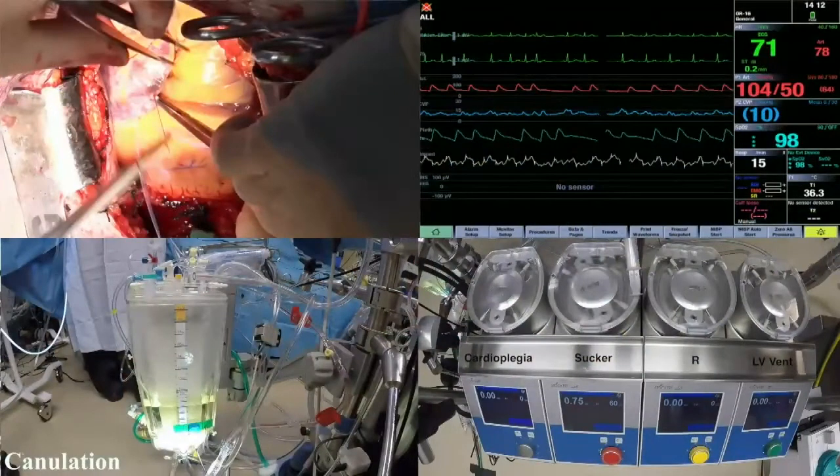Adrian, if you're watching. But when we first did it, you'll notice that we're missing that panel for the heart-lung machine. Can you go back and point to that for me? Yeah, that panel that was there. So the early cases we did, we missed that. In Mr. B's case, it's not there. But this is actually Mr. B's case. So let's play just a little bit of this.